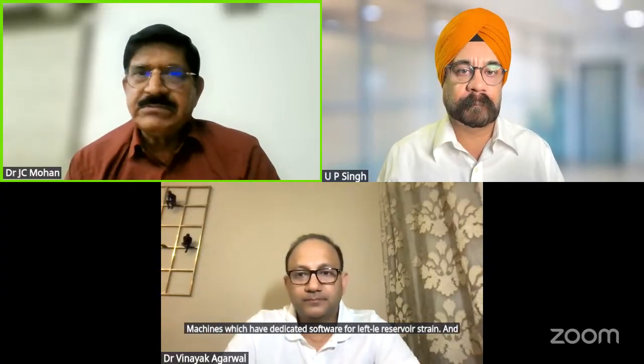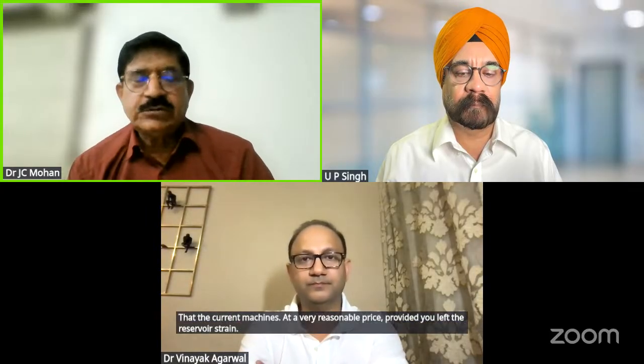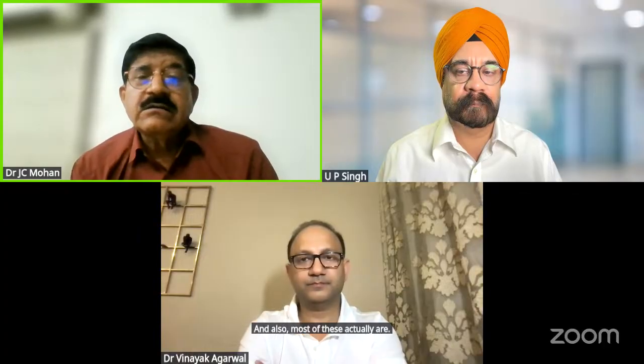And it is possible to get it at a very reasonable cost. I am quite aware that the current machines at a very reasonable price provide you left atrial reservoir strain. And also most of these actually are fully automated systems.